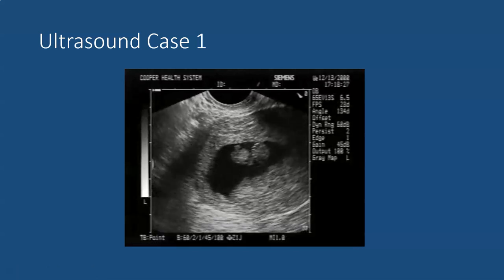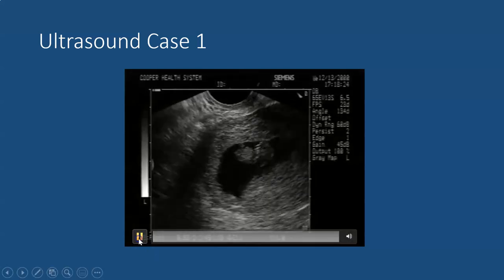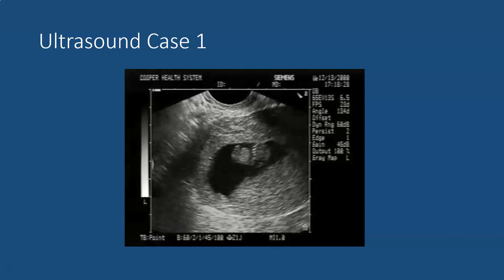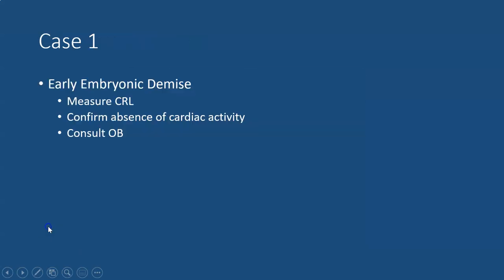In this transvaginal scan one can see a large irregular appearing gestational sac with a fetal pole which looks kind of slumped upon itself. As you look in the thorax you don't see any clear cardiac activity. This is an early embryonic demise. Once you've confirmed there's no cardiac activity and verified that it is large enough that you should expect to see it by doing a crown rump length, consultation with OB to discuss further management would be appropriate.